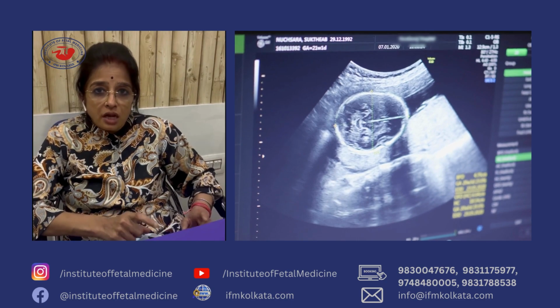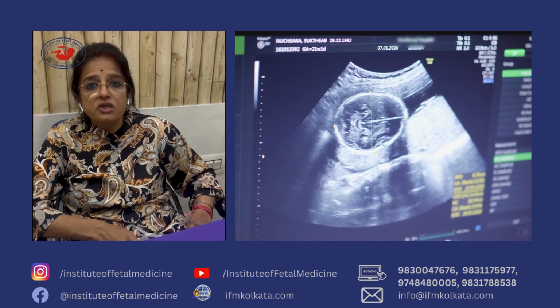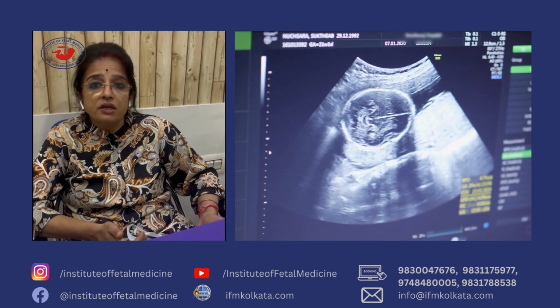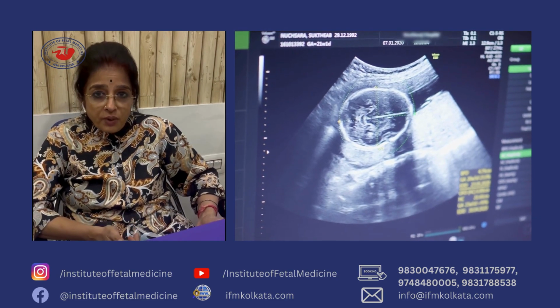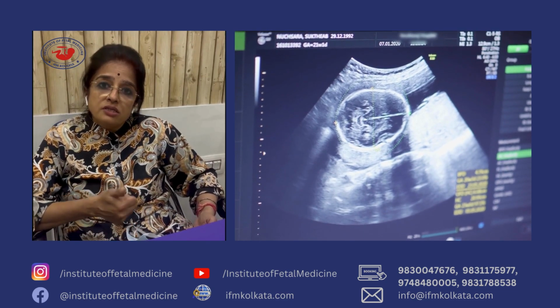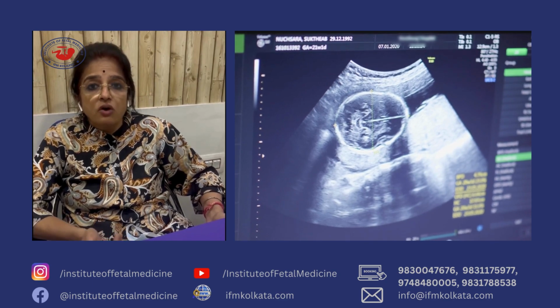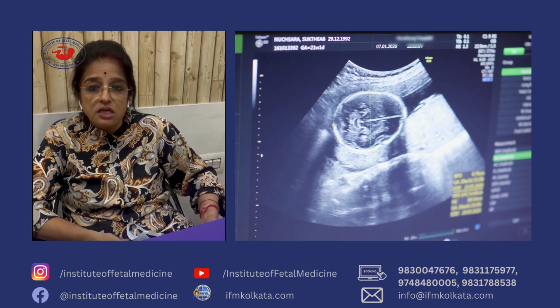Obstetricians do advise TVS for pregnant patients, and there are several indications, like diagnosis of a very early pregnancy sac in a pregnant mother, to locate whether it is inside the uterus or implanted outside the uterus, which we very commonly call an ectopic pregnancy.